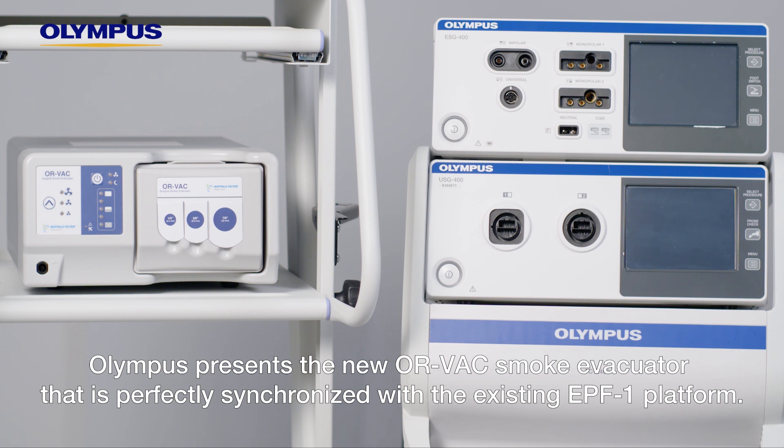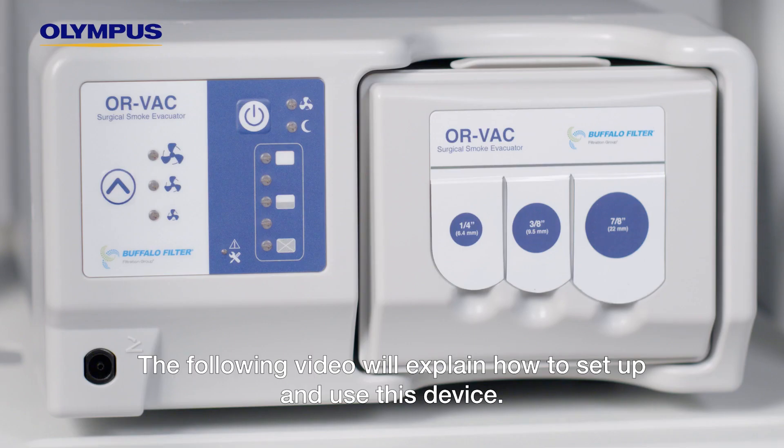Olympus presents the new ORVAC smoke evacuator that is perfectly synchronized with the existing EPF1 platform. The following video will explain how to set up and use this device.